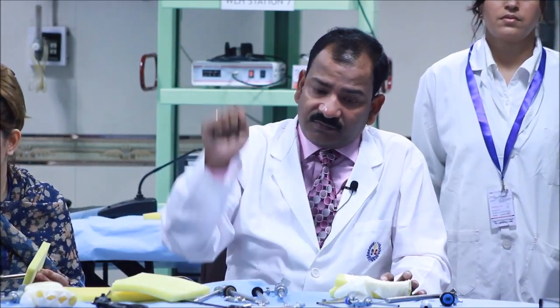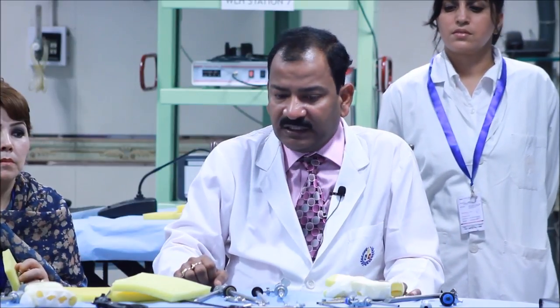And always under vision. Do you know why we are using the Veress needle? There are a few questions from you. There are a few published articles which have demonstrated that the Veress needle is not required; we can directly put the trocar. According to those articles, the primary trocar has less injury than the Veress needle. In the camps in India, for sterilization camps, they put the trocar directly. That is called direct trocar insertion, and a few published articles say it has less injury. The Veress needle creates more injury.